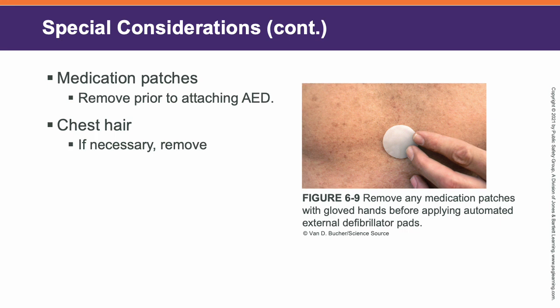Some other things to consider: if you know or you see the person has a medication patch, remove it before you use the AED. If you use the AED while that patch is on them, the medication can actually mess with the conductance of the electricity, and it may not work effectively.